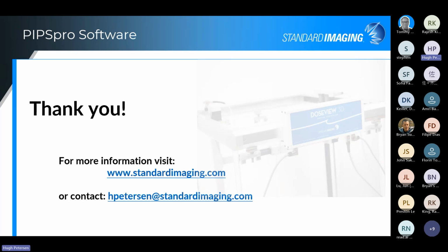So one thing I didn't mention is that the 5.9 should be released in the next few weeks, and it will be available as a standalone module for use with our CT SimCheck Phantom, or it will also be incorporated into the full package of PIPSpro. So it's something that you can customize to your specific needs. So if you're doing TG142 in a different manner, and only want to utilize the CT SimCheck module, that will be available as a standalone module. But I think that covered all the questions.